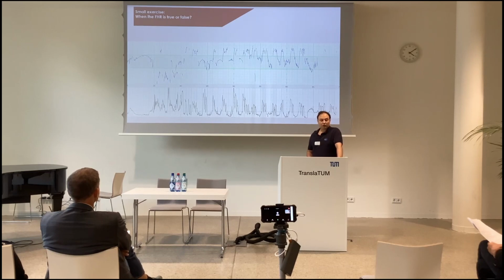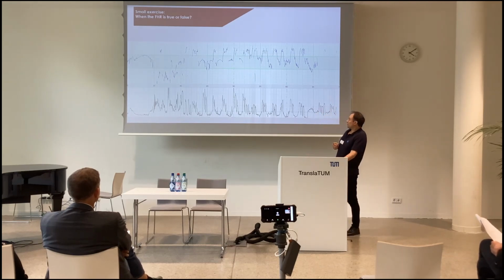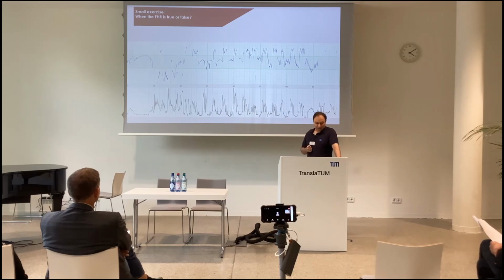So you all know that the Doppler channels may be contaminated, capturing maternal heart rate instead of fetal heart rate. So we'll start with a small exercise. Are you able to say, in this recording of the second stage of delivery, when is the true FHR and where is the false FHR?